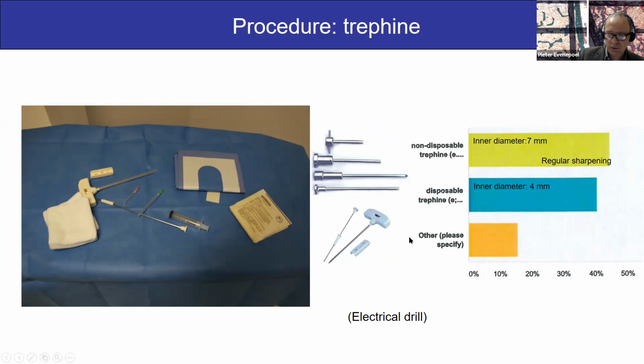That certainly makes it easier, as you don't have to sterilize the needle or sharpen it regularly. So nowadays it makes it easier to perform a bone biopsy everywhere, and this is gaining popularity amongst nephrologists. In the survey at that time in 2017, about half of the nephrologists were using the big Bordier needles, and half were using the Jamshidi type needles. Use of an electric drill is something used by some nephrologists, but certainly not the majority. And I personally have no experience with an electrical drill.